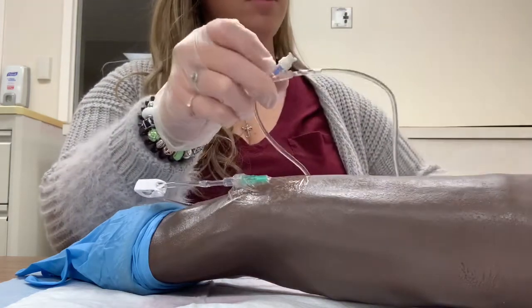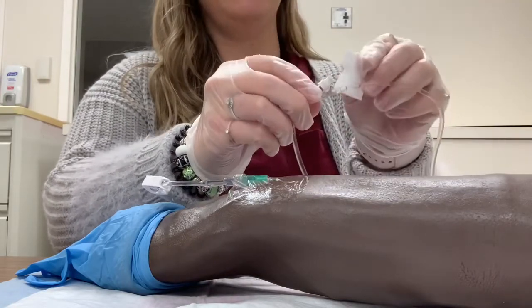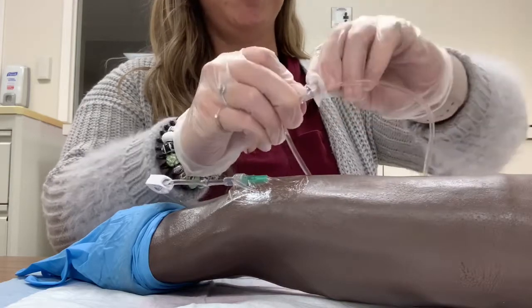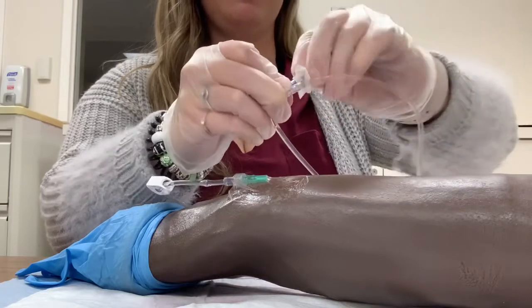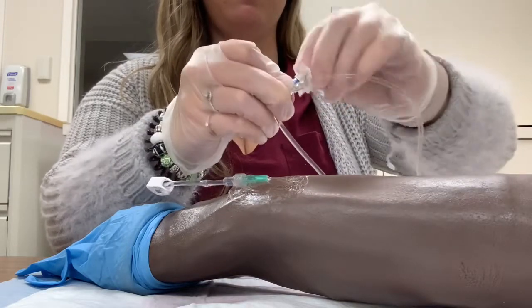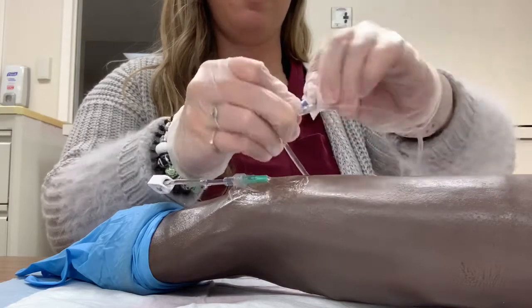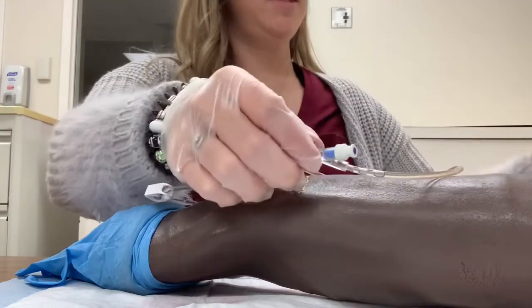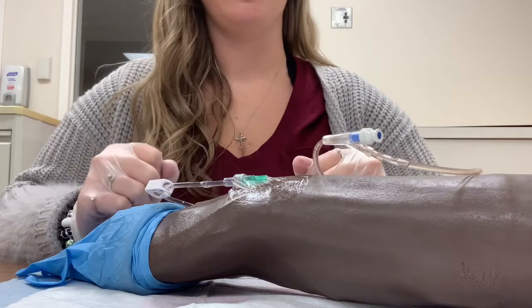I would take my alcohol swab and alcohol it off for 15 seconds, then let that dry. I would take my gloves off, wash my hands, and document.